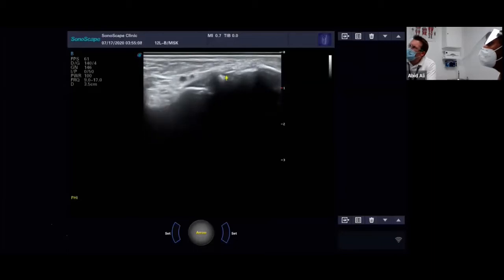Yeah, I mean, they do look like this when you have an injury. They look a mess. It's quite difficult to make them out. Can you see I'm just inverting his calc? I'm just trying to do a little stress test there.